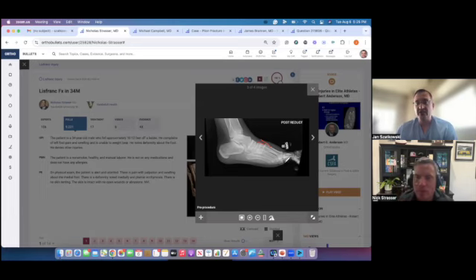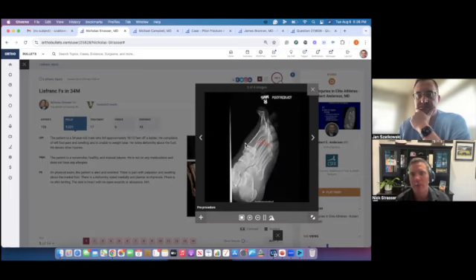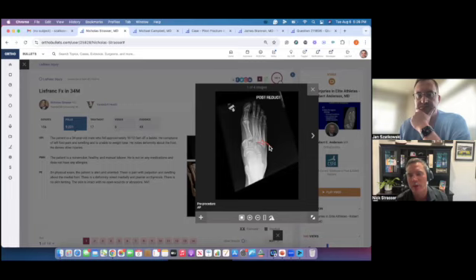But they're extremely unstable injuries, because you've torn all the structures. Like you said, it's a ligamentous injury, so you get it looking okay, and then all of a sudden you can chuck the foot back and forth fairly easily. I think that's a great point, because it's going to be hard to hold it there stable, and sometimes they even need provisional fixation or provisional pinning of that midfoot. So I think that's an excellent point.